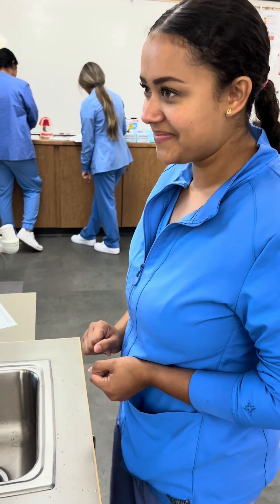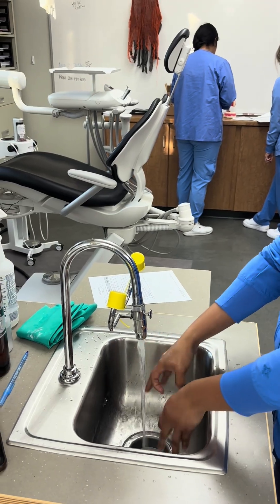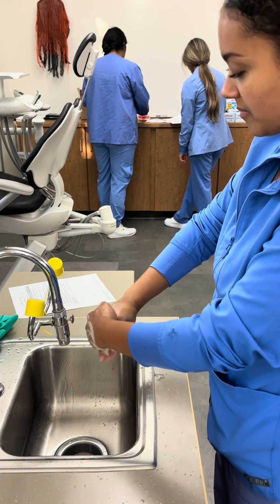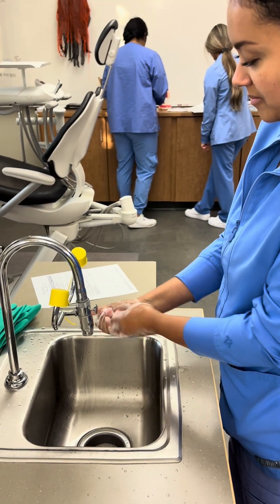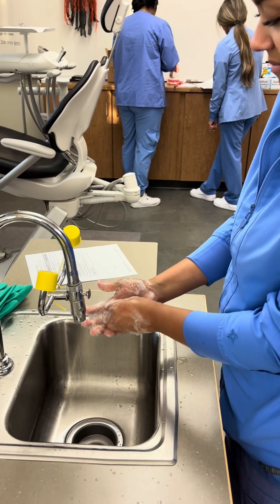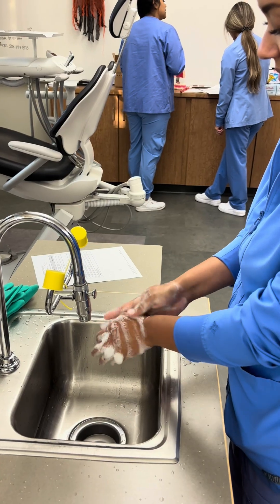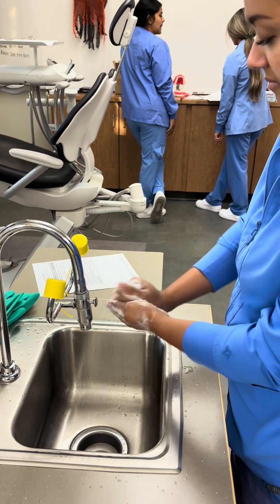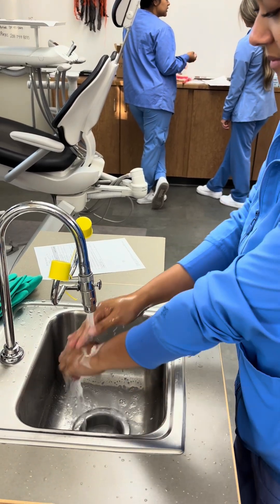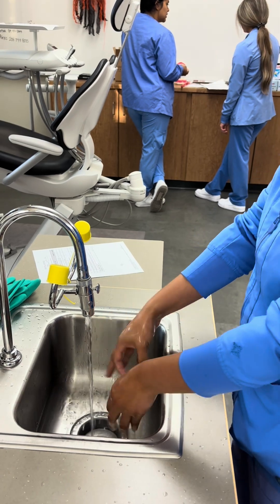This is Melissa and she's going to be placing barriers, so we're going to start by washing her hands. She's going to get everywhere that everything will touch and she'll get under her nails. She'll rinse and then she won't touch anything until she dries her hands off.